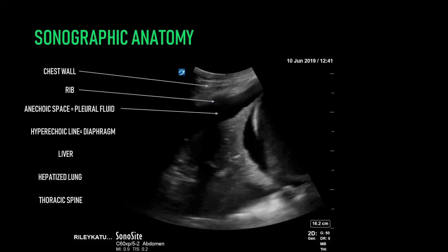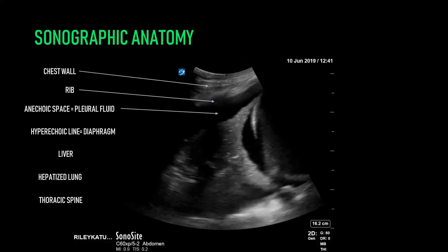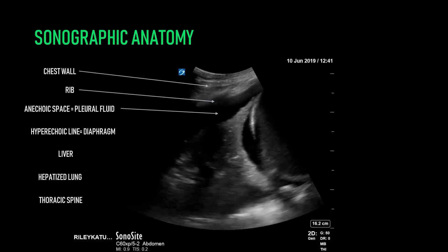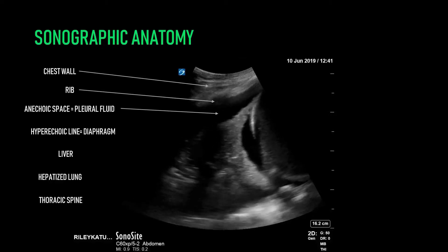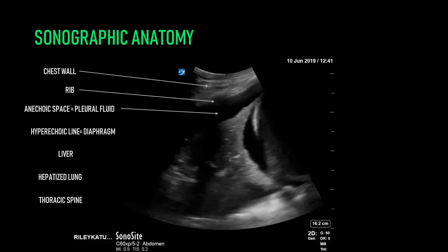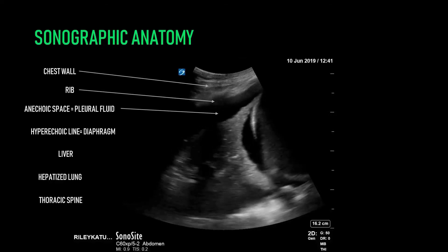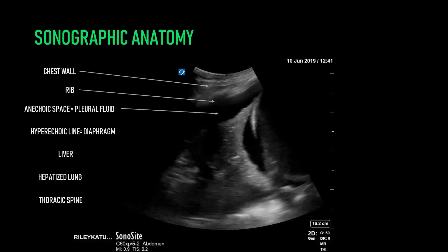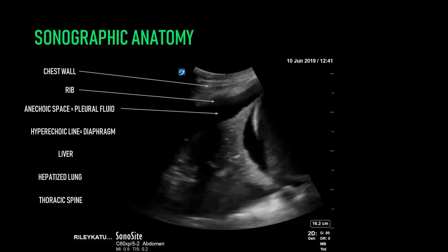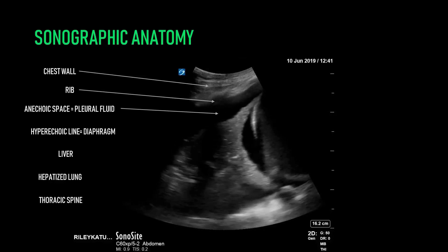Deep to the chest wall, in a patient with a pleural effusion, you should see an anechoic space. If you don't see an anechoic space immediately deep to the chest wall, the patient may still have a pleural effusion, but it's unlikely to be accessible via a percutaneous drainage technique.